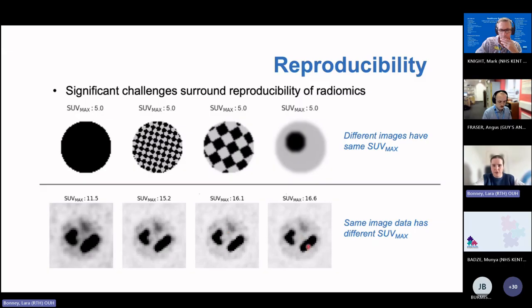And so this is a huge reproducibility issue. We can't then take models that were trained in one centre and use them in another centre because of the differences in the way the models behave. And this is particularly relevant to us, I think, as clinical scientists, because we're often responsible for how we can implement these algorithms or check that they're working in our data. And so being able to understand how they behave is really important.